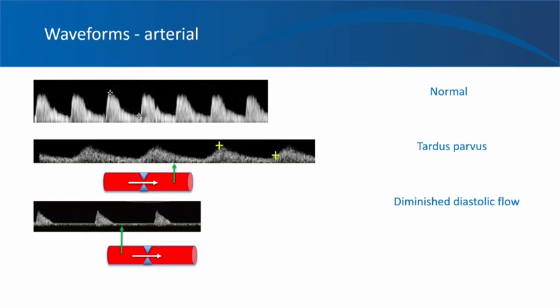This kind of flow essentially indicates that there might be an obstruction downstream, and/or the blood is not flowing during diastole, indicating distal obstruction. Always remember that distal disease increases resistance to flow, which means diminished diastolic flow and increased resistive index.